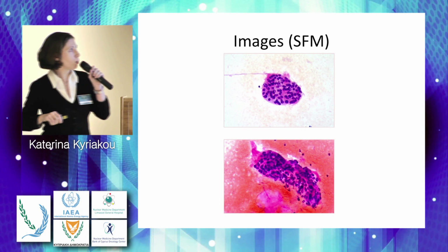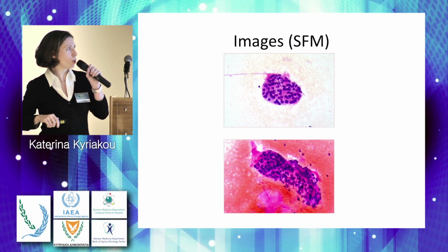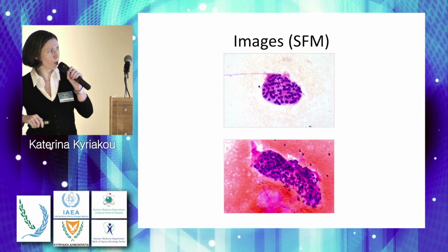This is a case where we put it as suspicious for malignancy. We have a few ill-defined intranuclear inclusions, which are characteristic of papillary thyroid carcinoma. And we have significant cellular crowding and overlapping here.